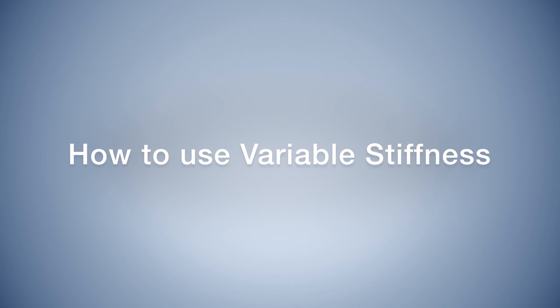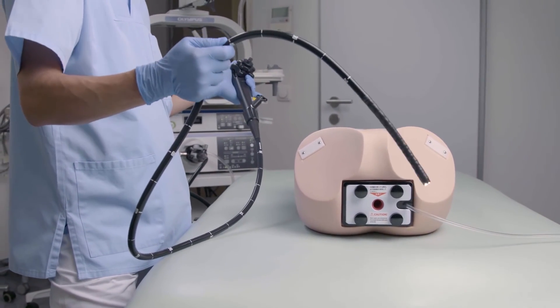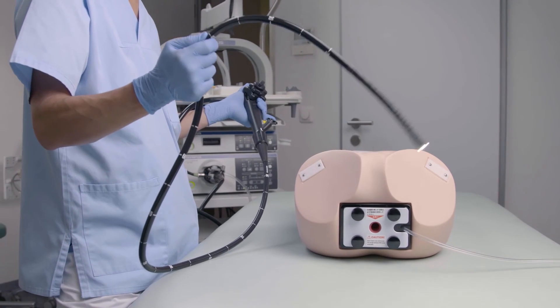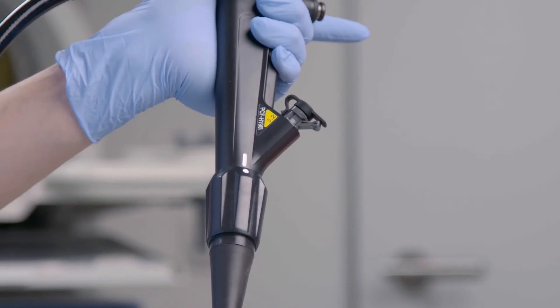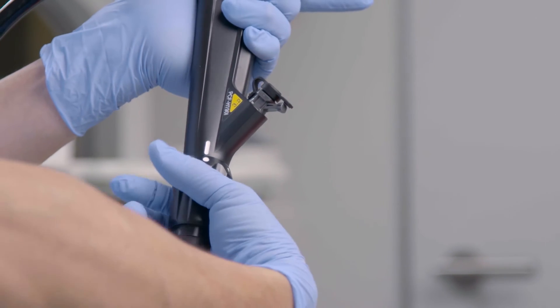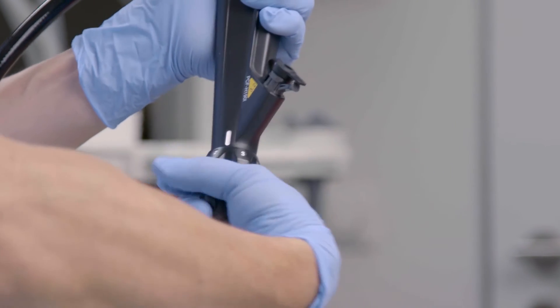How to use variable stiffness: after passing the sigmoid, a loop may reform. Variable stiffness might be helpful to prevent the sigmoid colon from reforming a loop. The default position is zero, and by rotating the ring, you can adjust the settings.